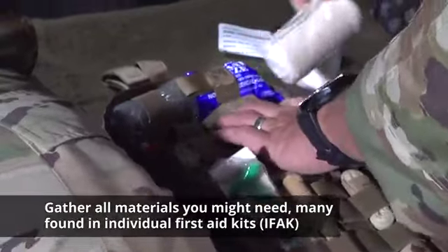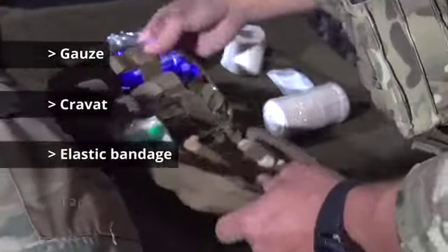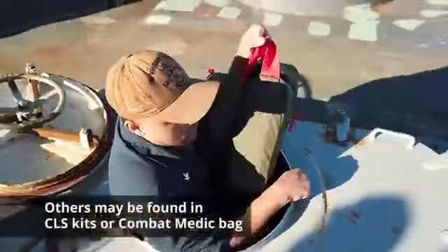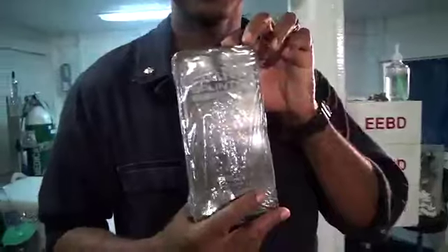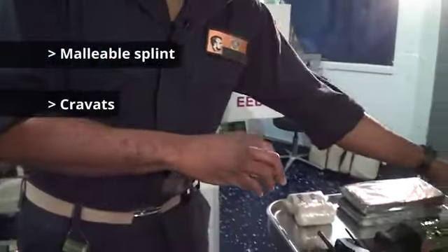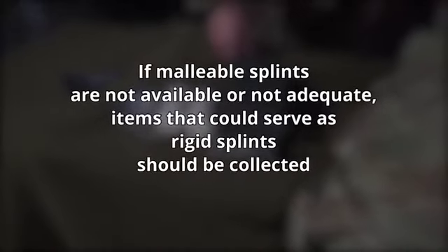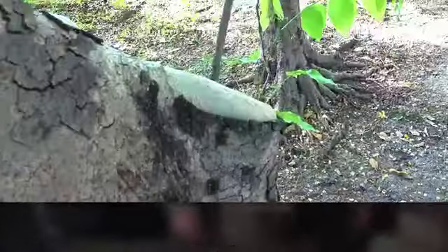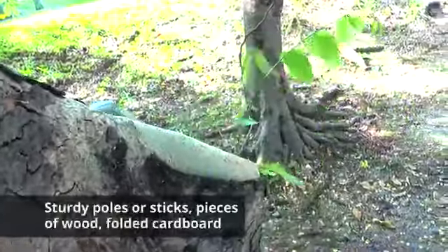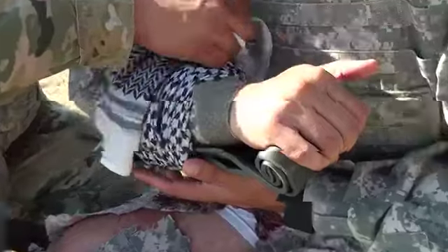Many of these are found in the individual first aid kits, like gauze, a cravat, an elastic bandage, and tape. Others may be found in combat lifesaver kits or in a combat medic bag. This might include a malleable splint, additional cravats, tape, dressings, and elastic bandages. And if malleable splints are not available or not adequate, items that could serve as rigid splints should be collected. For example, sturdy poles or sticks, pieces of wood, or folded cardboard. Padding materials can be made from extra cloth or even some types of packing materials.